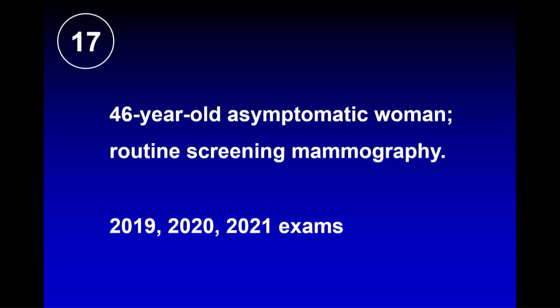You had a question. So when you biopsy that and it turned out to be DCIS, would that increase your suspicion for the contralateral? Not a lot, probably not. When you have bilateral cancers, they don't necessarily manifest by the same radiographic finding. Like you could have calcifications on one side and mass on the other side. It happens. More commonly, if you have bilateral cancers, they'll both have the same feature. But it's not always. So it doesn't really help.